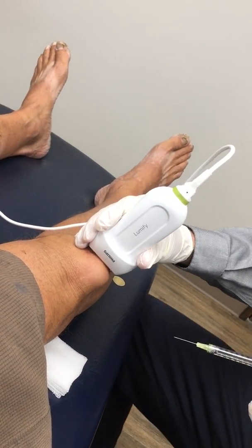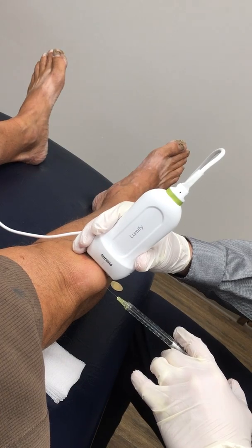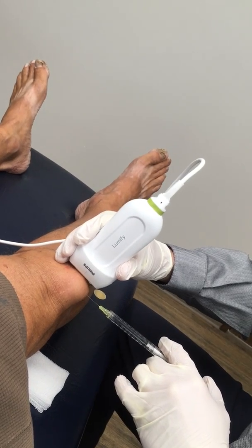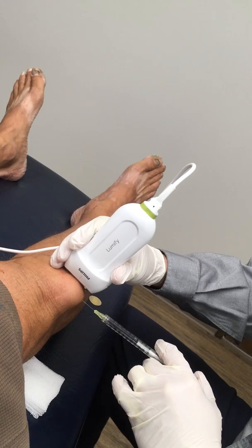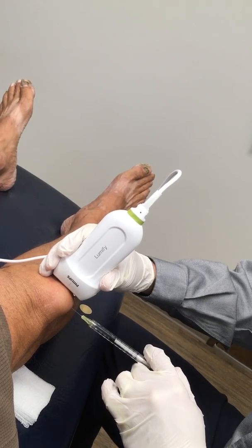So I'm going to do a little local anesthetic first of all. So you feel a tiny poke here, ready, 1, 2, 3. This is a 30 gauge needle with some lidocaine, and it kind of burns a little bit. Do you feel that burn very much? No, not too bad. I'm going to try to be nice. I'll just go nice and slow, and I find using local anesthetic, if I go pretty slow and use a small gauge needle, usually I make good friends with Reed.